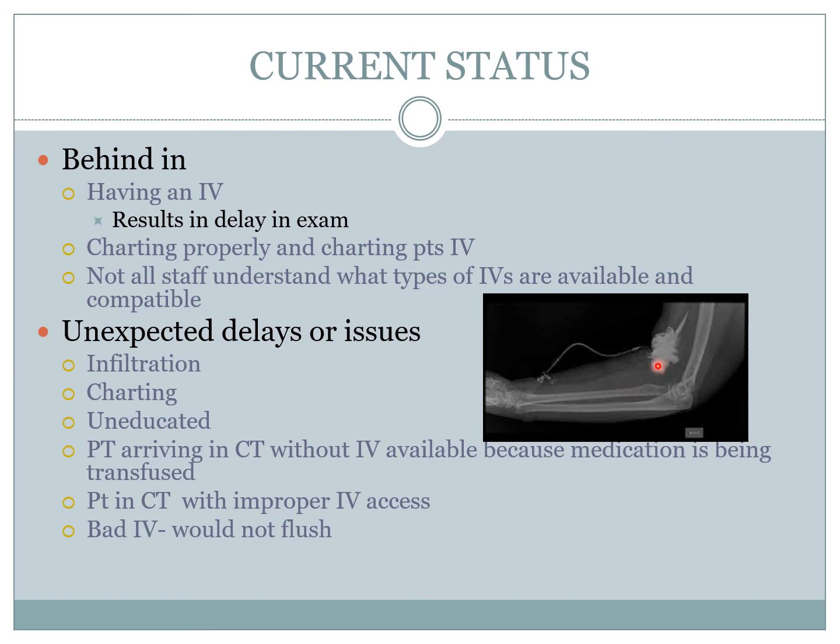Boom. It hits that contrast where it's infiltrated. So yeah, there's a dead end. And that means the answer is no. No, no, no, no. When there's an extravasation, I got that word that time.